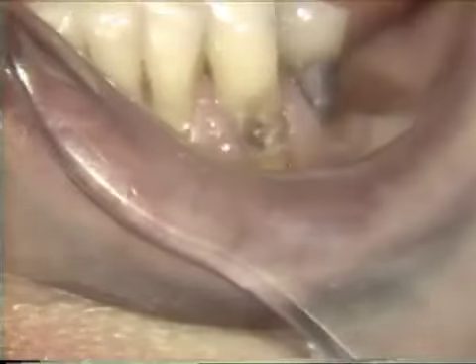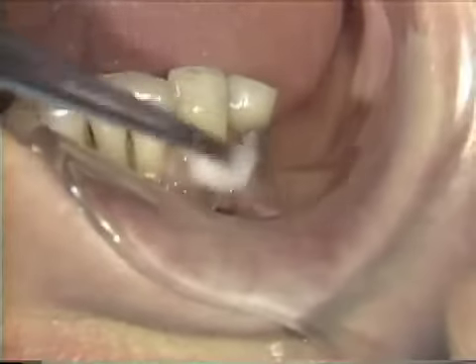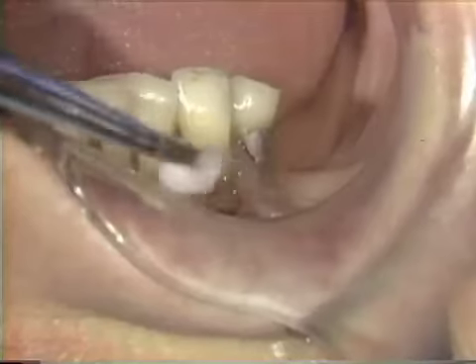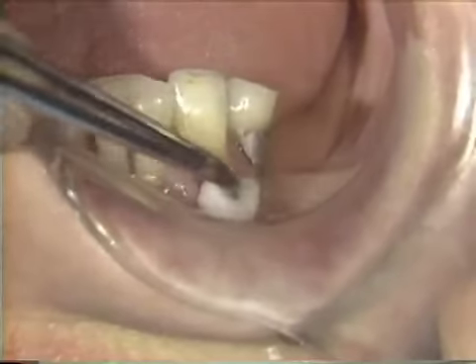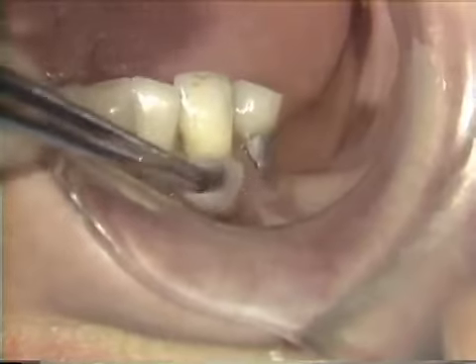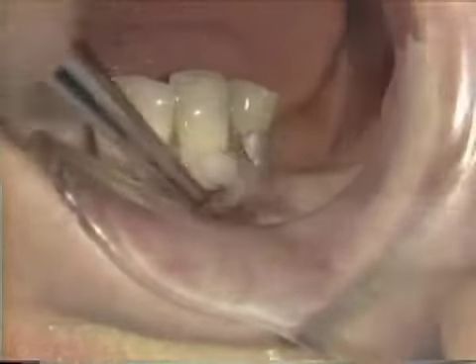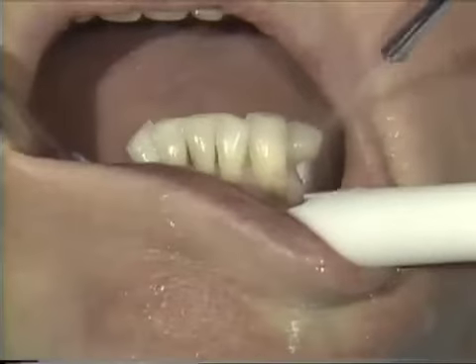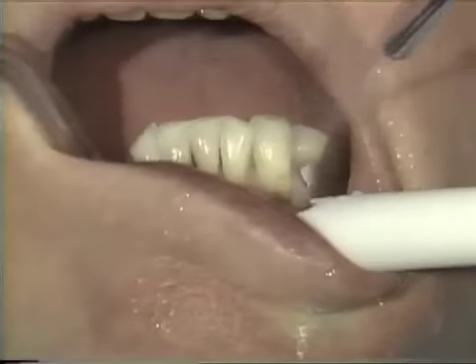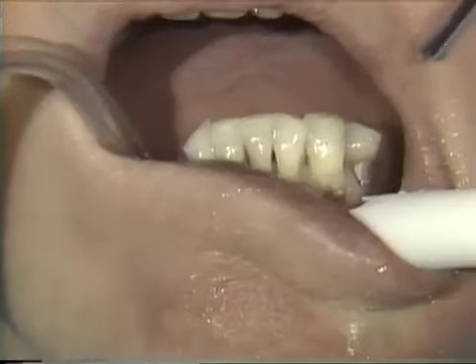Cotton roll isolation is used after the old restoration and caries are removed. The cavity is checked with an explorer. After rinsing the cavity preparation, a 10% polyacrylic acid rinse is used for 15 to 20 seconds to clean the tooth surface and to increase the bond strength of the glass ionomer by removing some of the smear layer. The polyacrylic acid is rinsed off for 10 to 15 seconds and quickly dried in order not to dehydrate the tooth.